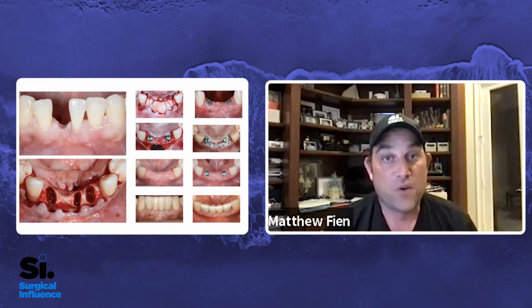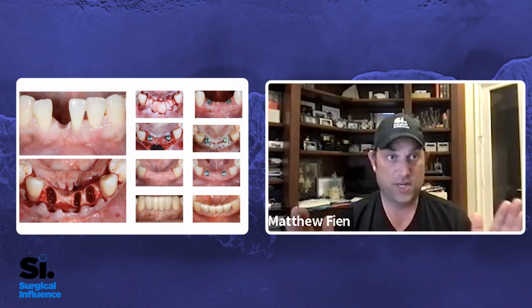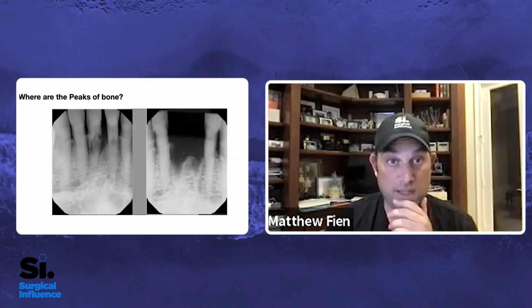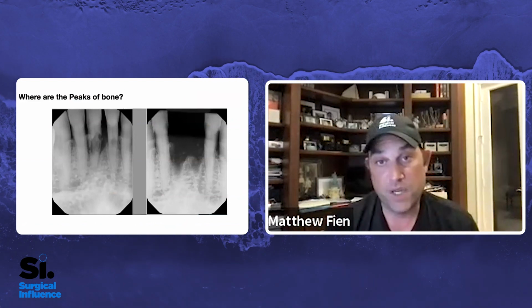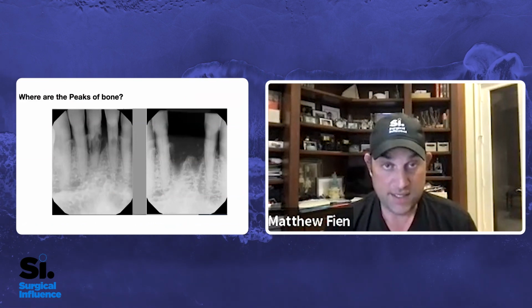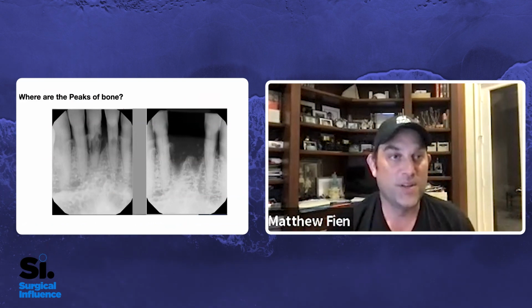And to me, it's a no-lose situation because you're going to get better aesthetics, I think, with having the 4 teeth done. But of course, the patient had 2 teeth that were an issue, and now you're kind of turning it into a 4-tooth problem. And if you look at the radiograph, those laterals do have nice long roots. They've got no decay. And this is a situation where we're looking to minimize the amount of trauma we're doing in patients' mouths.